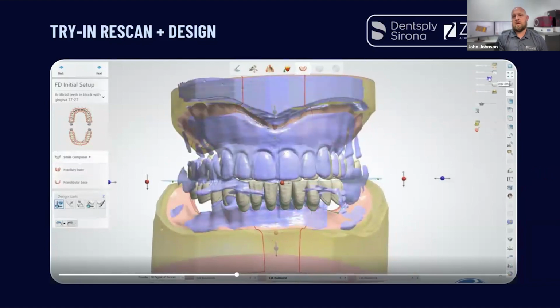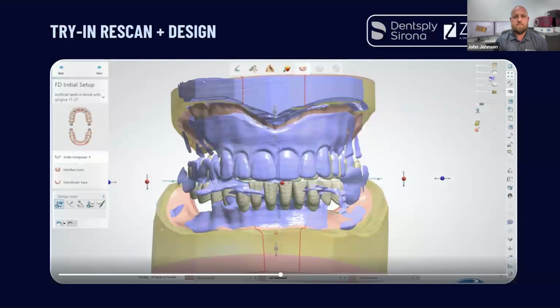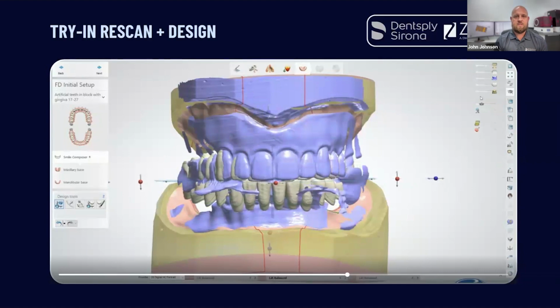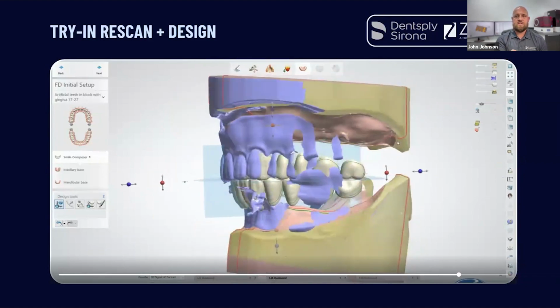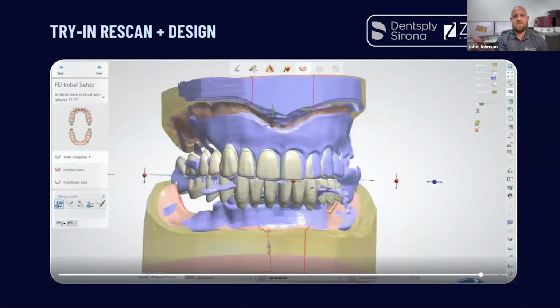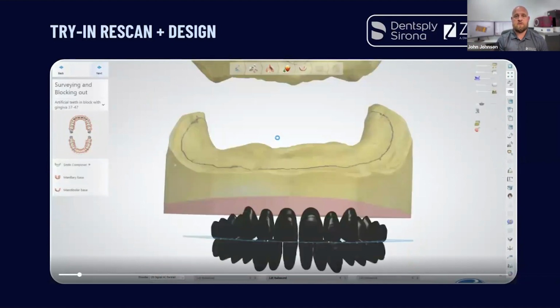So when you can communicate, say it's a midline issue, if the doctor says, hey, the midline needed to move over 2 millimeters to the left, I'm able to pull up that denture and manipulate that arrangement accordingly. The same goes for the incisal plane, the incisal edge position, the plane of occlusion. All those communication aspects can be easily corrected because you can see it and you can overlay it. And that's just been a really good communication tool for me in my laboratory.